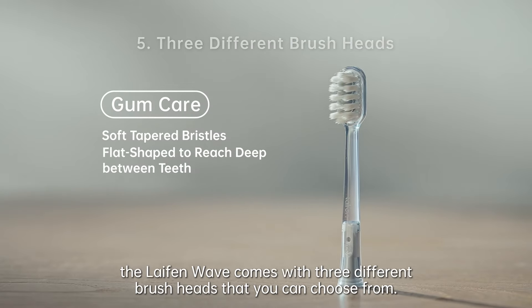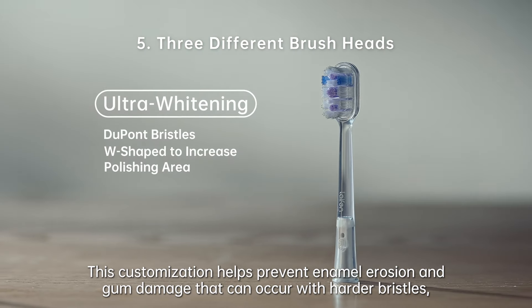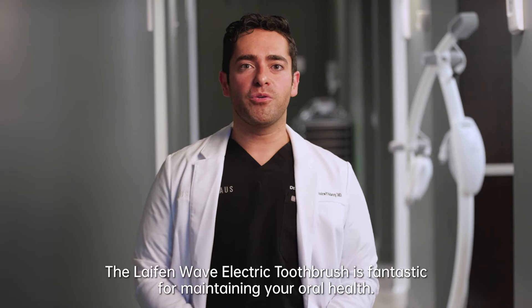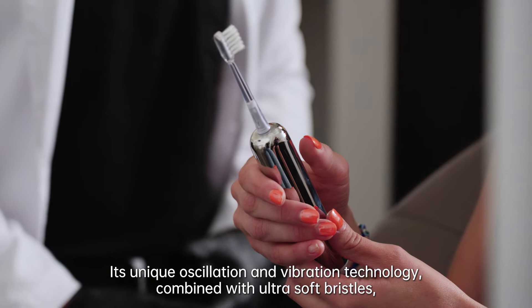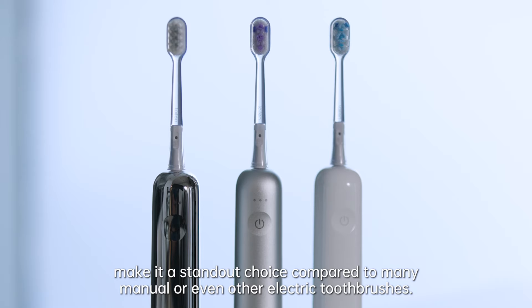Unlike manual toothbrushes, the Laifen Wave comes with three different brush heads to choose from. This customization helps prevent enamel erosion and gum damage that can occur with harder bristles, giving you a comfortable brushing experience. The Laifen Wave electric toothbrush is fantastic for maintaining your oral health. Its unique oscillation and vibration technology combined with ultra-soft bristles make it a standout choice compared to many manual or even other electric toothbrushes.